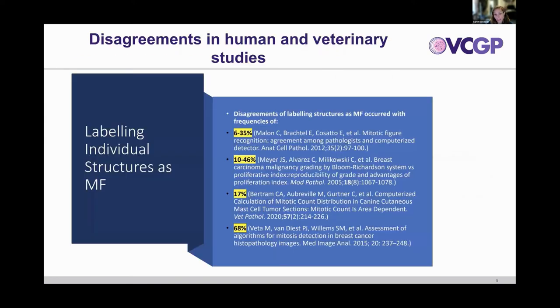Despite having these van Diest criteria, disagreements in labeling structures as mitotic figures occur with variable frequencies. In some of these papers — three from human pathology and one from veterinary — the ranges are pretty wide from 6% to 68% disagreement, which is quite significant.